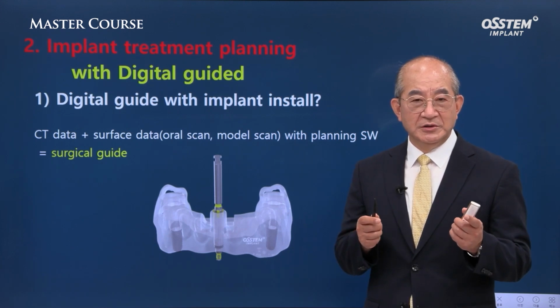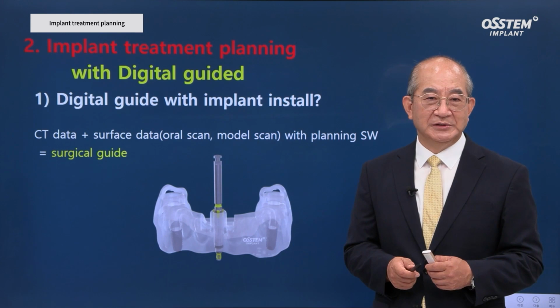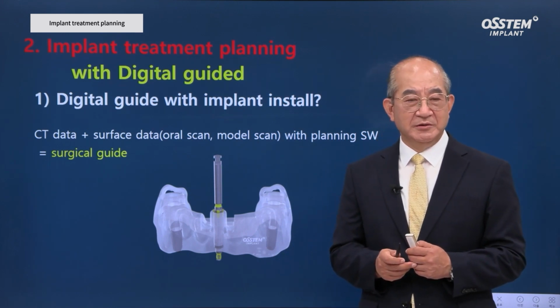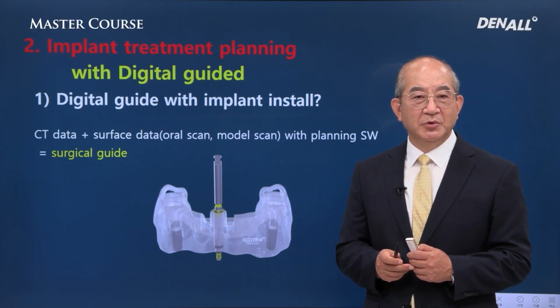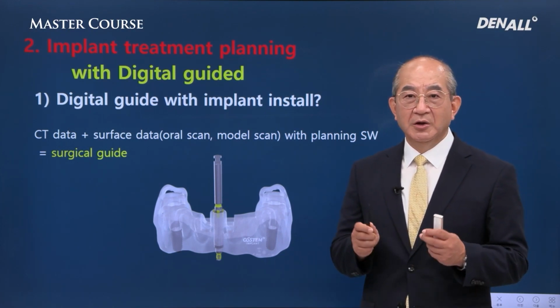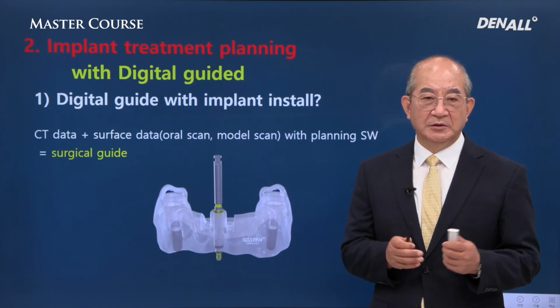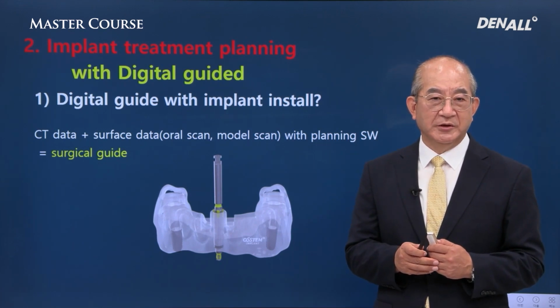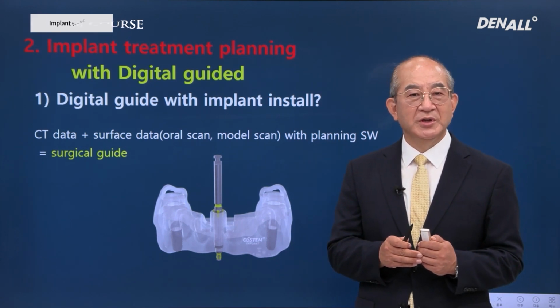You can also see the X-ray images taken earlier on the computer if you connect them. Digital dentistry is key these days. CBCT for dental purposes is most widespread in Korea. Patient information can now be acquired more accurately compared with the past. This is implant treatment planning based on digital guides.